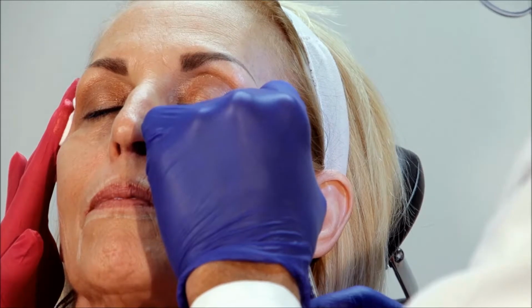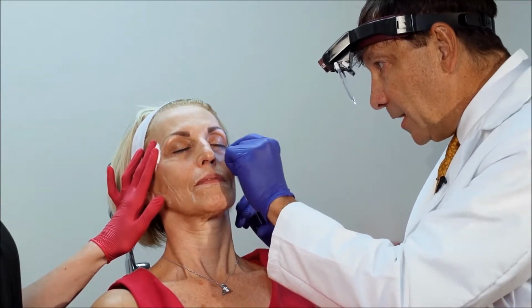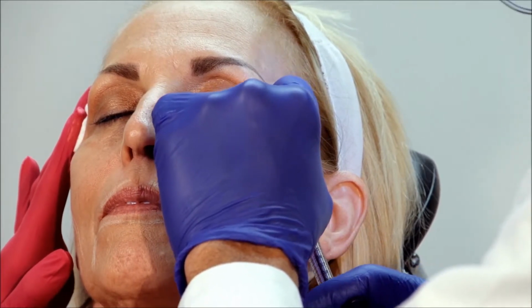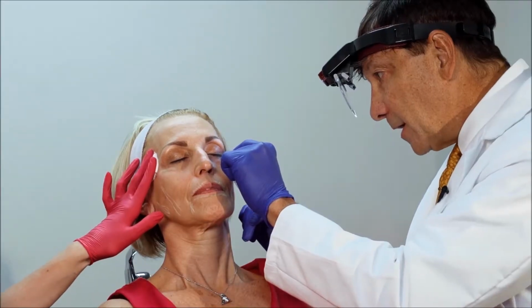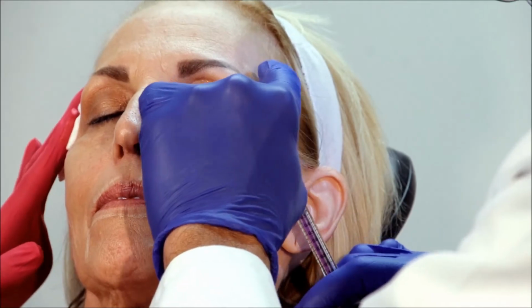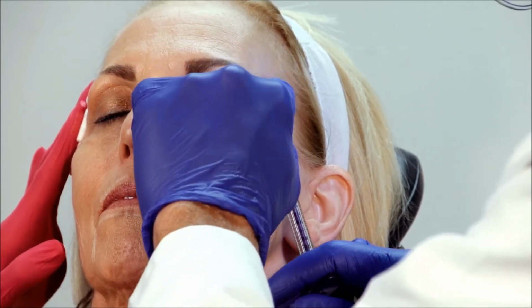The one thing I will always tell people is that whenever we treat in the temple, because of the veins up here, sometimes the veins will look more noticeable, not because we've done anything to the veins, but simply because of the filler. The veins become engorged with blood temporarily, for a day or two or three, and then it settles down. And again, I'm using a micro cannula, and my goal here is to get volume right into this subcutaneous anatomic space to restore volume, soften this area, and also get a little bit of elevation of the brow.